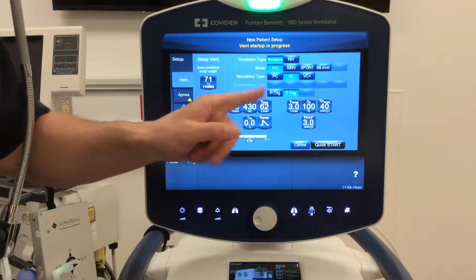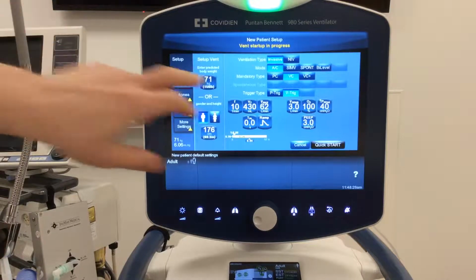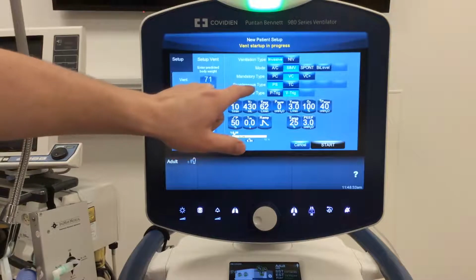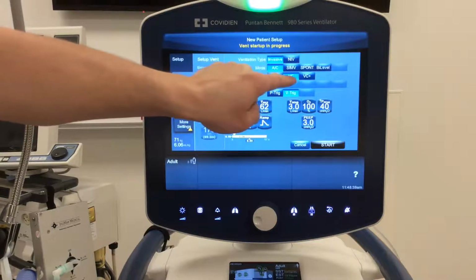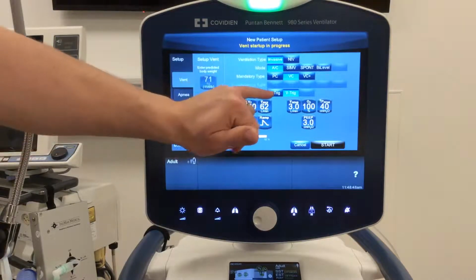Okay, so spontaneous breaths are not available in this mode of ventilation, all right? In assist control, all breaths are mandatory, so it is grayed out, okay? However, if I switch to SIMV, something we'll talk about later, it does add on spontaneous breaths, and that's something we'll focus on in a separate lecture, okay? So I'm going to choose assist control. We're going to choose volume as our control variable, so we're going to give a consistent size of a breath every single time. Spontaneous, once again, grayed out.